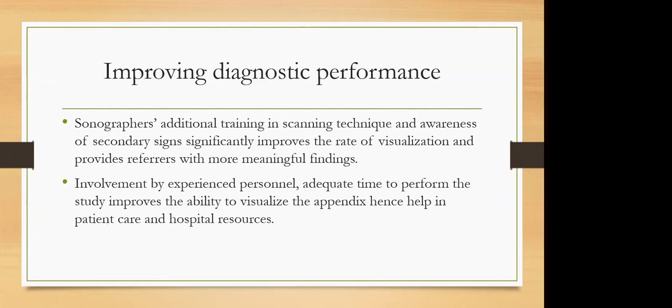Improving diagnostic performance. We all know how to do ultrasound, and we all know how to scan for appendicitis, but we don't practice as often as we are supposed to. In that case, we lose our skill to identify the appendix. I've seen most people say, it's difficult, let's just send the patient for CT.